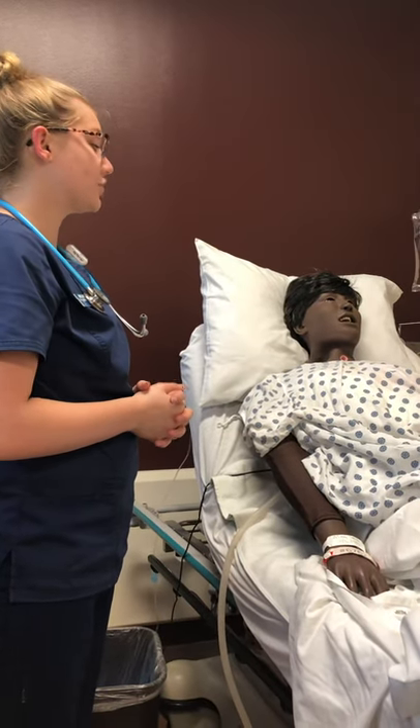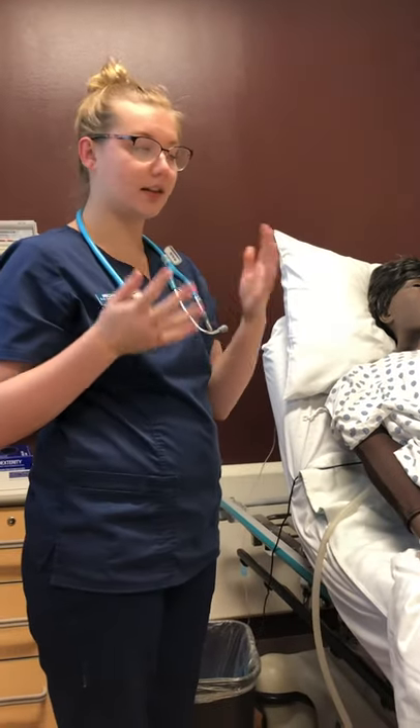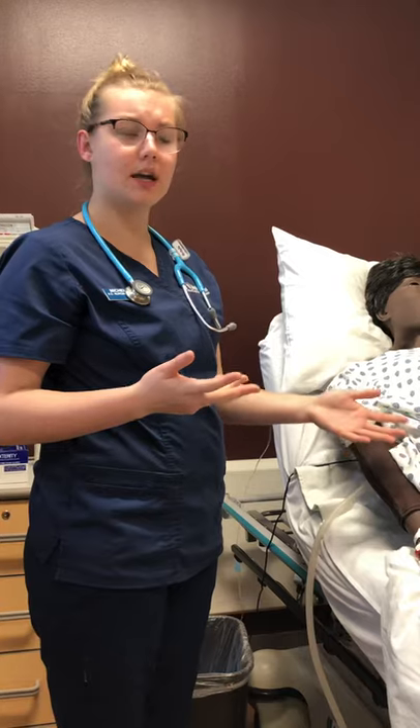We want to reposition her every two hours — we don't want any ulcers or to make anything worse. If Mary was a child, I would want to make sure the child is comfortable. If they're not sure what a stethoscope is or anything like that, I can have them use it, making sure they're comfortable but still having a thorough assessment.